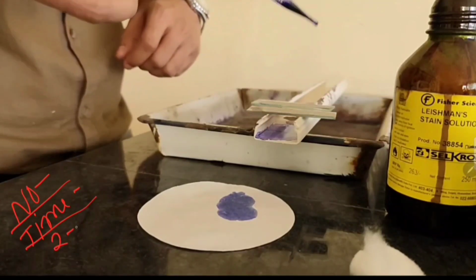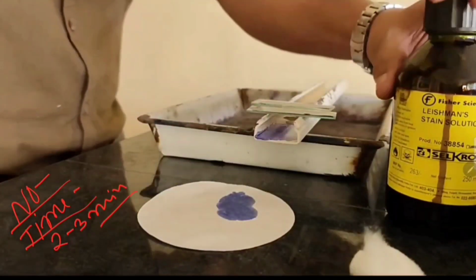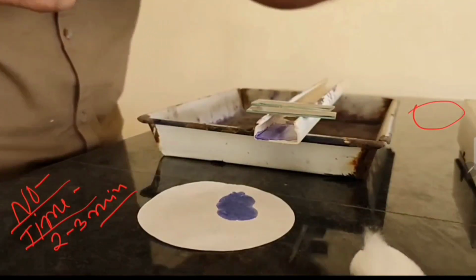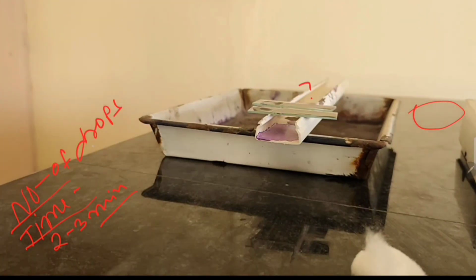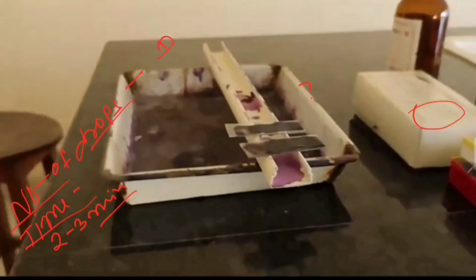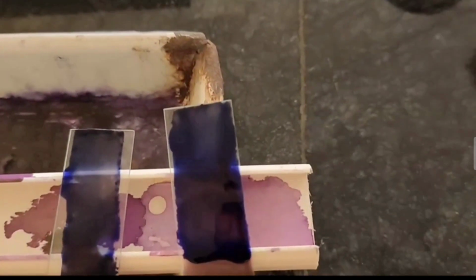We have to wait for 2 to 3 minutes for fixation. So we are adding Leishman stain, but this is not going to stain actually. Now this is going to fix actually. The number of drops of Leishman stain, the same number of drops we will need of distilled water. Here we can see this is covered already with the Leishman stain, and after 2 to 3 minutes we can move on.